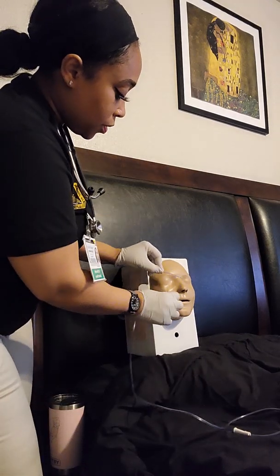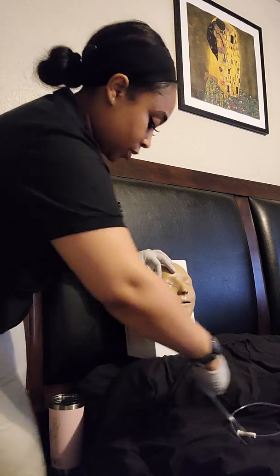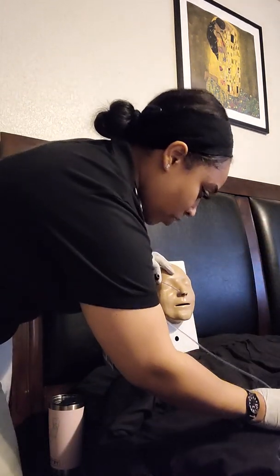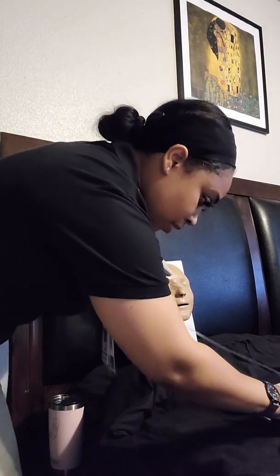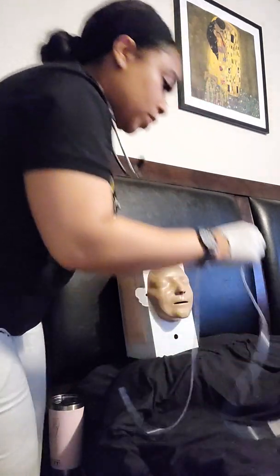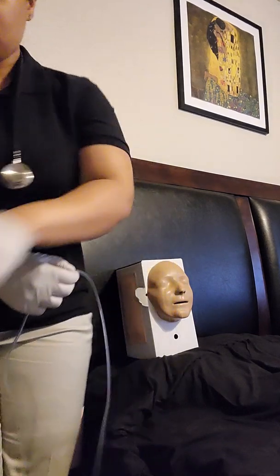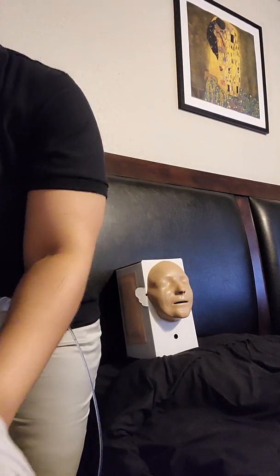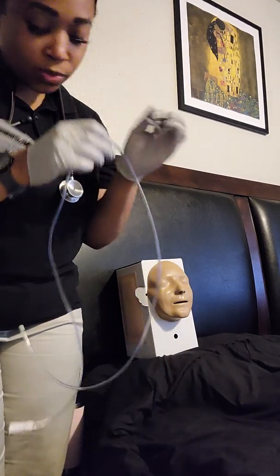So I'll start at the tip of your nose, behind your ear, and I'm going to stop at your xiphoid process. All right, so I'm about 60 centimeters down, and what I am going to do is go down another 3 centimeters. All right, I'm going to mark that with my Sharpie so I can know where to stop at.